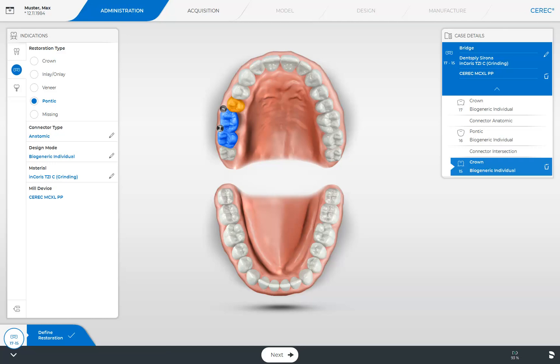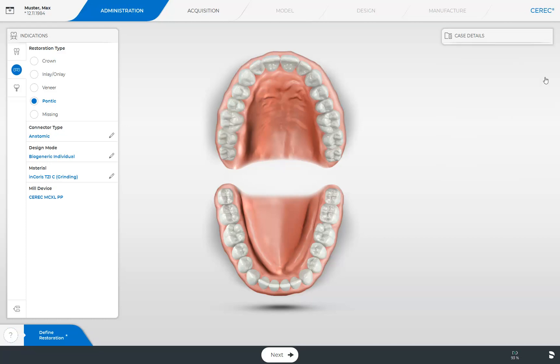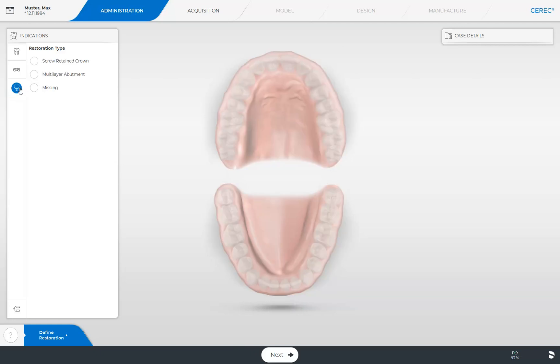The icon next to the odontogram has now changed, and in the window under Case Details, Connector Intersection is displayed. With another click, the connector type will change back again. We delete our restoration and proceed with the implant restoration type. This restoration type offers different options: we can choose between a screw-retained crown and a multi-layer abutment. If you haven't made a final decision yet about the type of restoration and prefer to define this after viewing the initial design proposal, the multi-layer option should be turned on. This way, you can choose the final restoration type in the design phase using the split and unsplit tool.